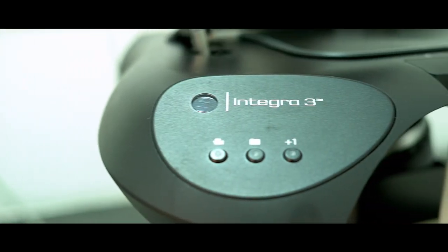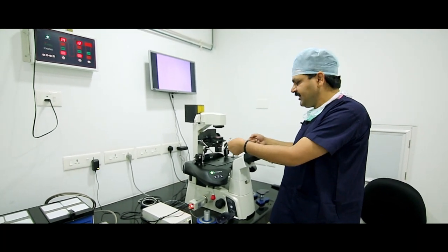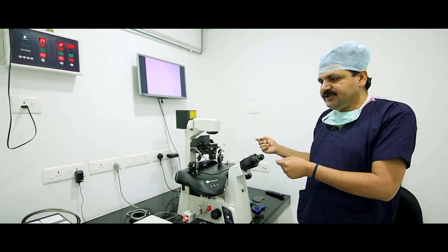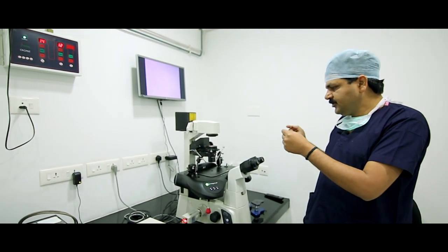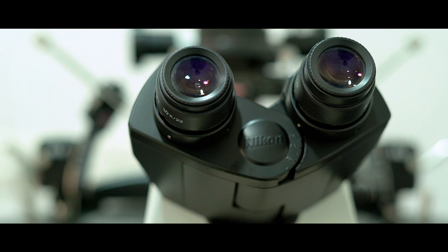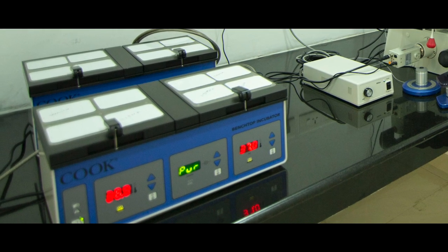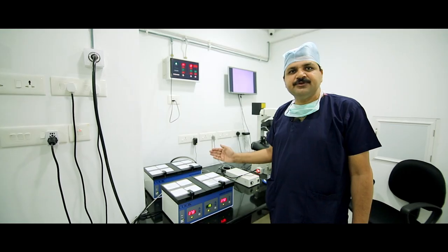This machine has a heating stage, and the embryologist sets up the holding pipette and injection pipette. First, we immobilize the spermatozoa with the help of the injection pipette. After selecting a good morphological sperm, the embryologist performs sperm injection under the microscope — one sperm into one oocyte. After injection, we culture our zygote in the triple gas incubator and observe pronuclei fertilization check after 16 to 18 hours of injection.